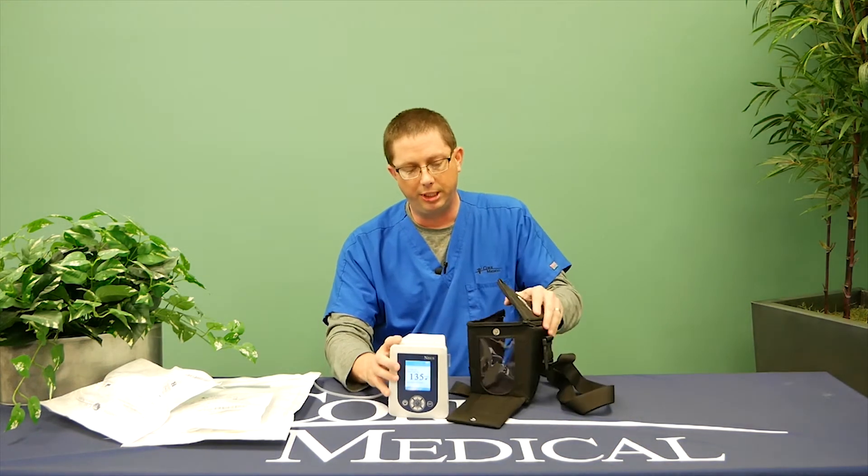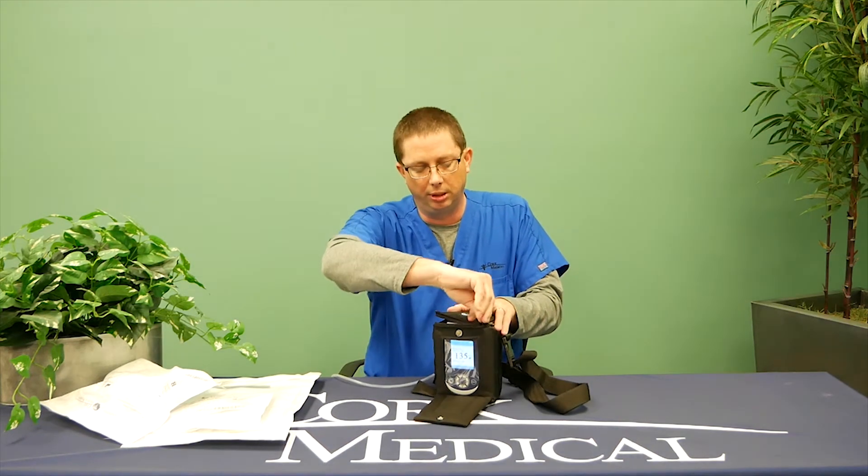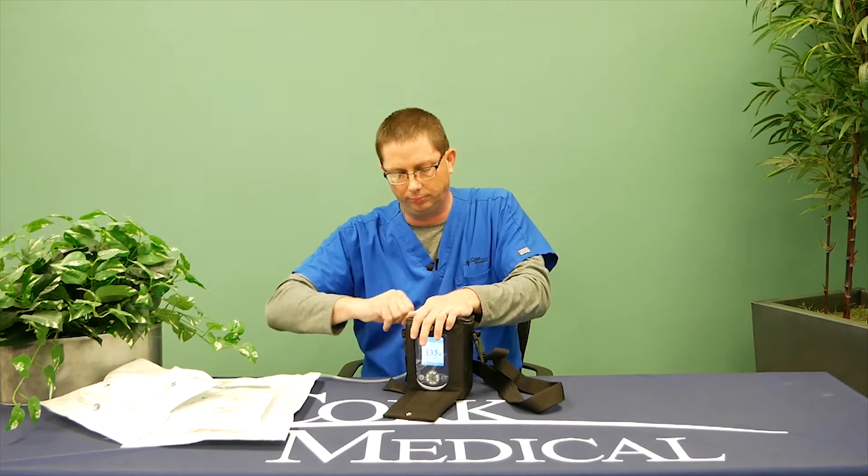When you're done replacing the canister, please place the pump back in the black bag, zip up the top, and close the front pouch. Now your therapy is resumed back to where it was previously.